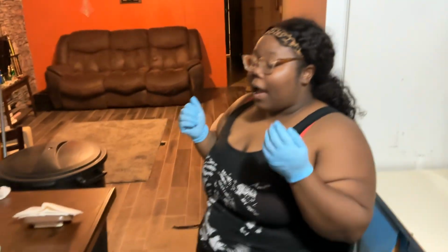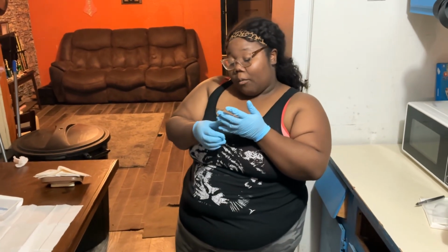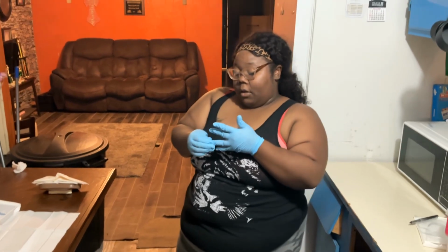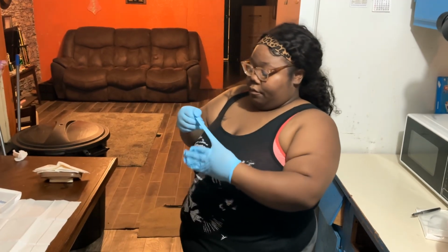Hands are up. Now, in this moment, I can discard my gloves because the wound is covered and I'm no longer having to be sterile. But I'm not going to discard these gloves because I only have one pair and I need them for my tracheostomy care and suction video. We're just going to remove these gloves. Remove them.